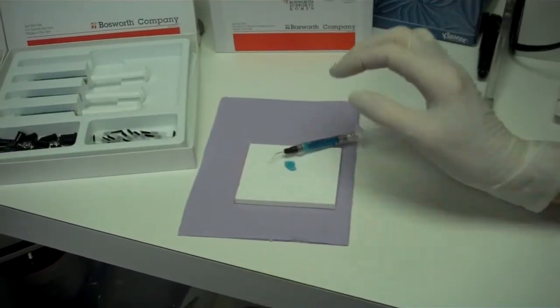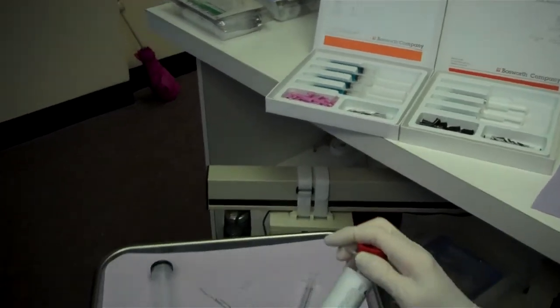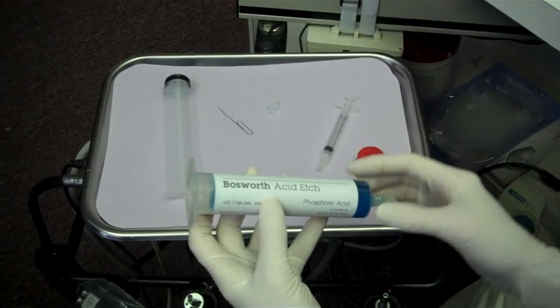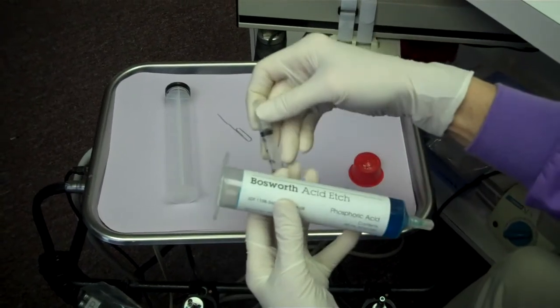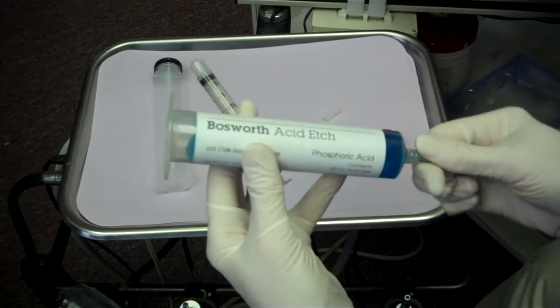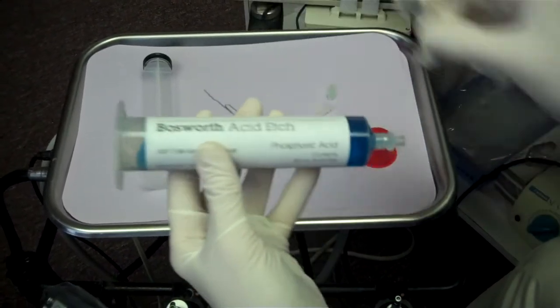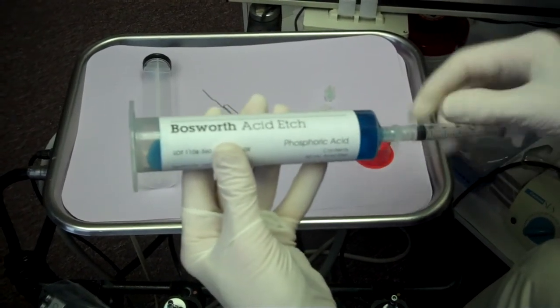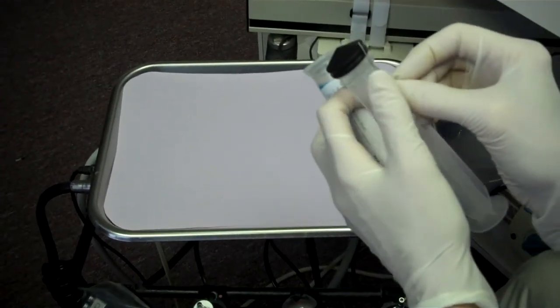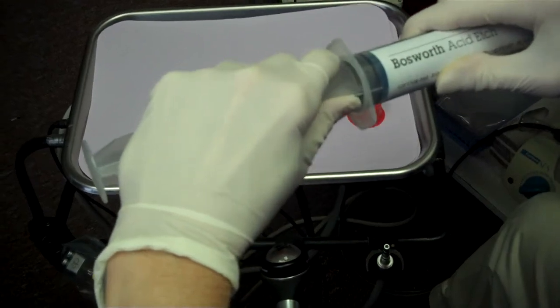A very economical package for Bosworth Acid Etch is the 60 gram jumbo syringe, which comes complete with three empty 3 milliliter syringes. To load an empty syringe utilizing the jumbo syringe, you first remove the red stopper and attach an empty syringe. Next, the practitioner places a small wire alongside the plunger and then gently starts the plunger into the syringe, filling the empty syringe.